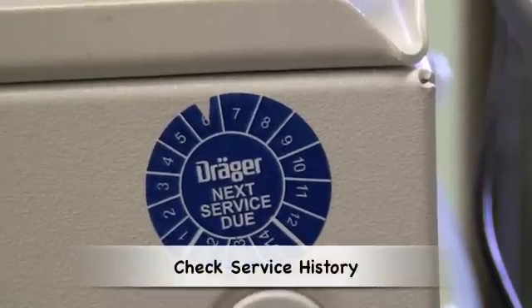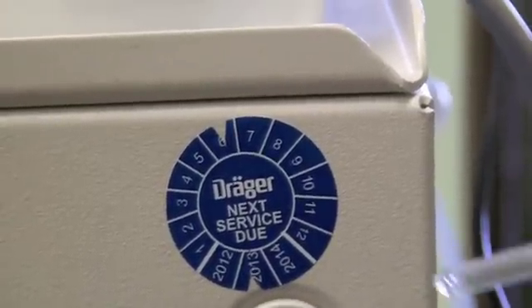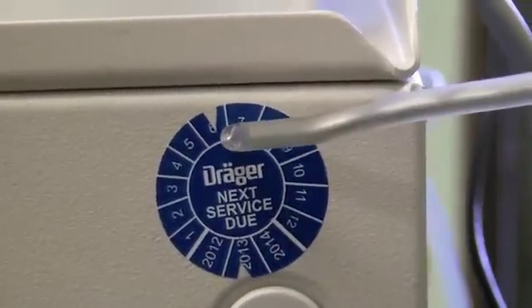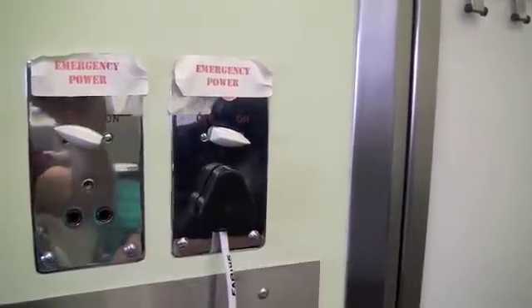To start with, you need to check the service history of your machine. This tag indicates that the machine is next due for service in June 2013. The anaesthetic machine must also have its own designated emergency power source.